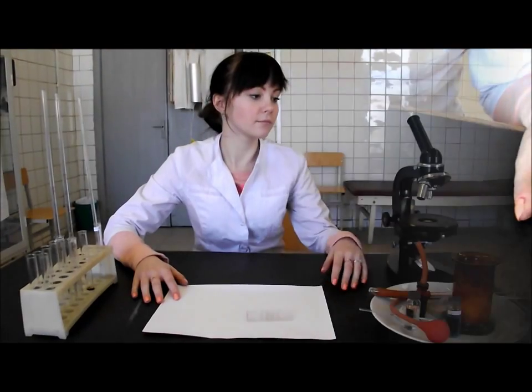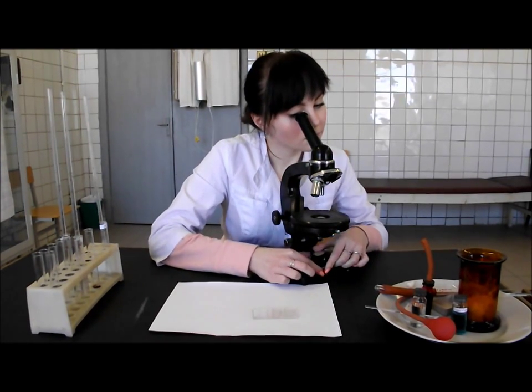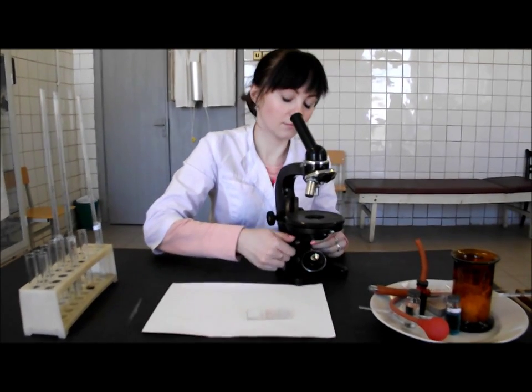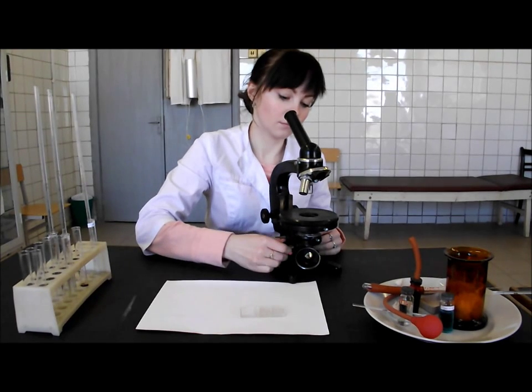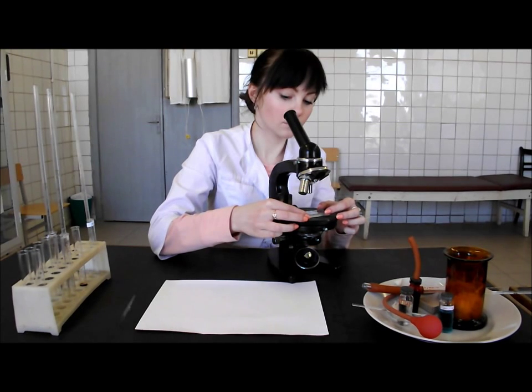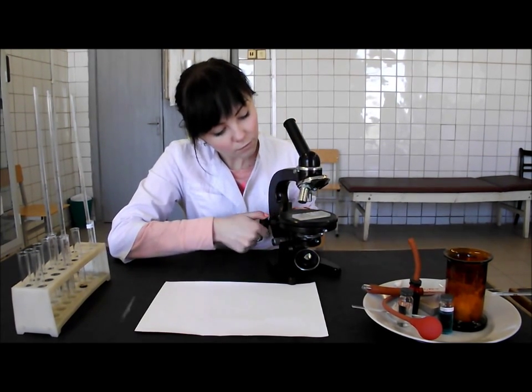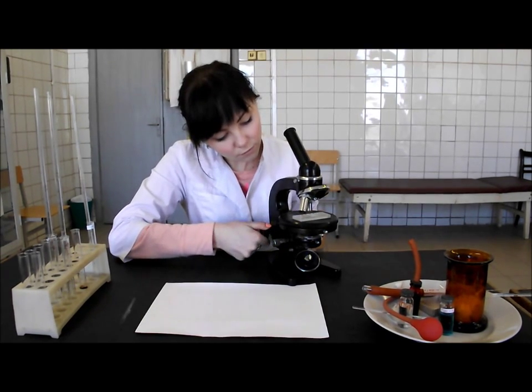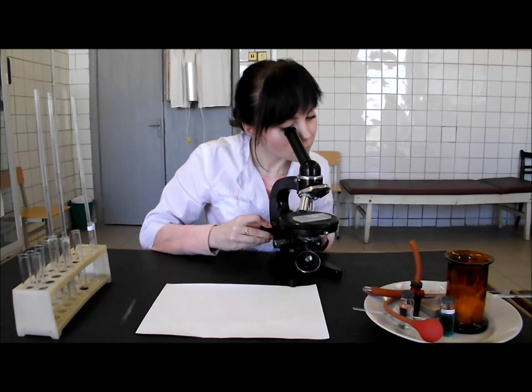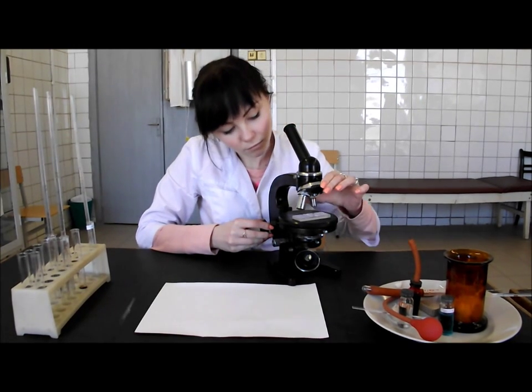Take the microscope and light the field of view. Put the condenser completely down. Put the central part of the chamber exactly under the objective lens. Count the erythrocytes under large magnification in five big squares situated in different places of the meshwork in diagonal directions.